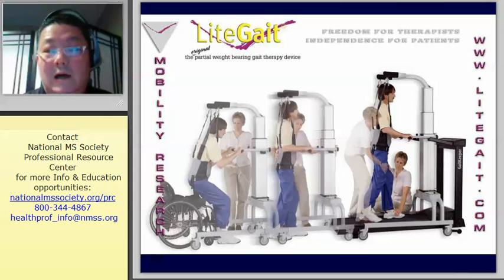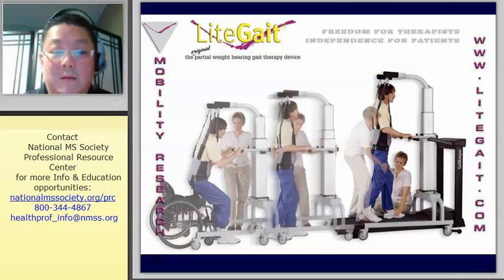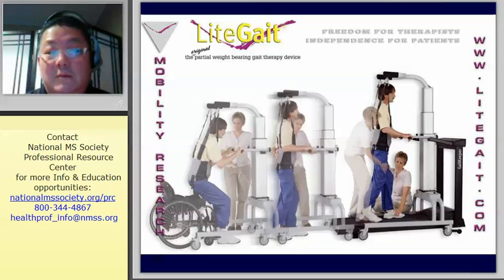How often do we get our MS patients into a quote-unquote aerobic activity? Not enough. So perhaps on top of this, being able to get them to walk in a body weight supported system might be the way to go. So either taking out the Lokomat or even the Biodex devices, being able to offload them will get them the ability to get their aerobic capacity kicked in.